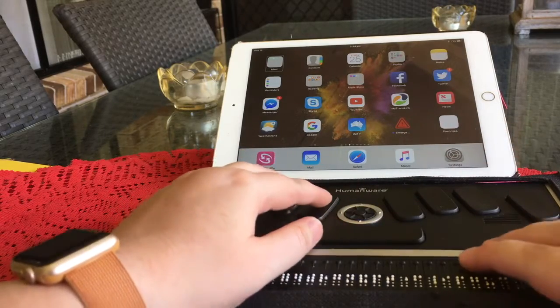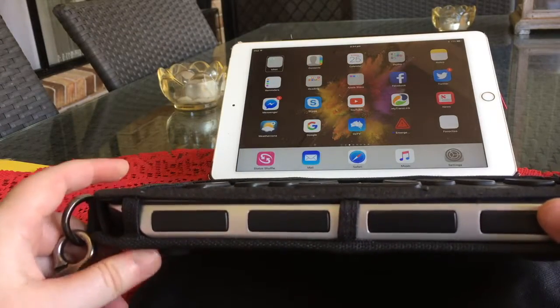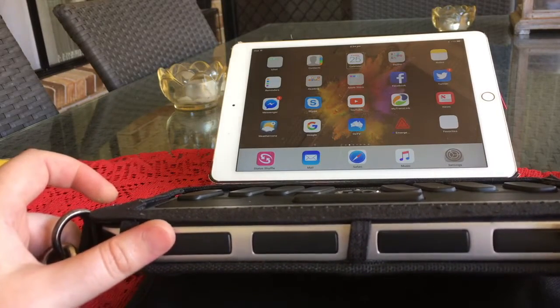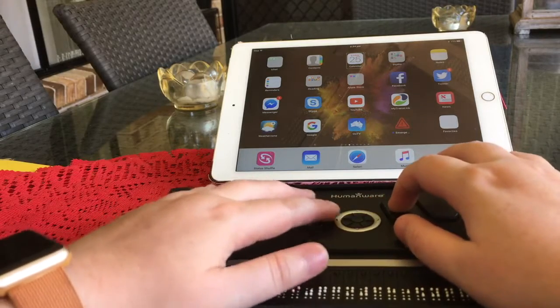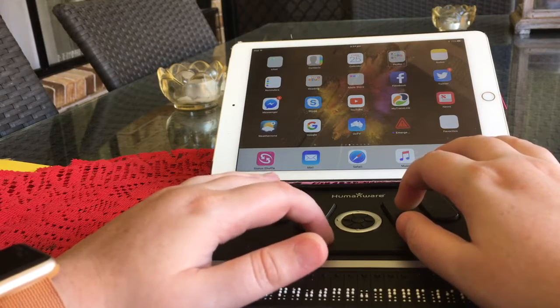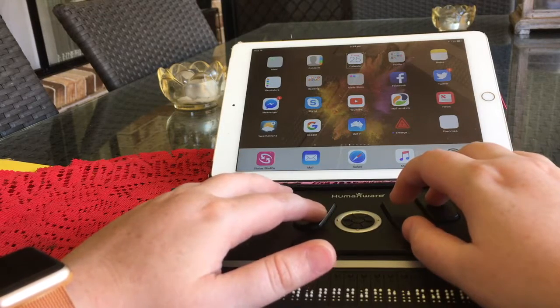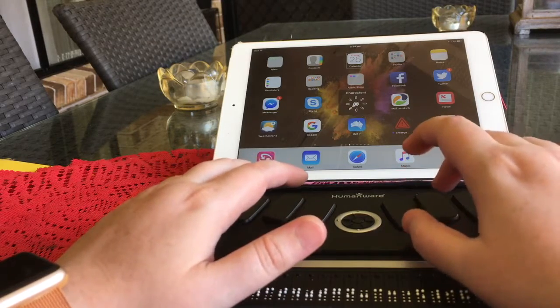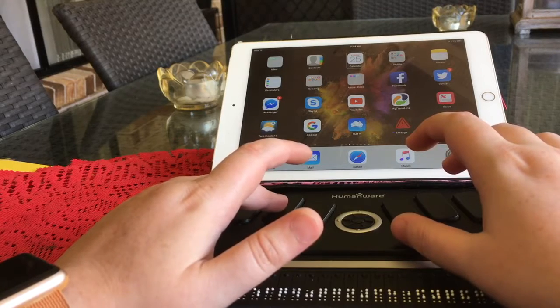To do the equivalent of swiping one right, we can use the thumb keys — which is probably the simplest way of doing it. And to swipe back is the opposite thumb key, the ones on the far side — Next and Previous, I believe they're called. Or we can press Space with dot four to swipe to the right, or Space with dot one to swipe to the left. To access our rotor settings, it is Space with dots four and five. And to swipe back the other way through the rotor settings, it is Space with dots two and three.